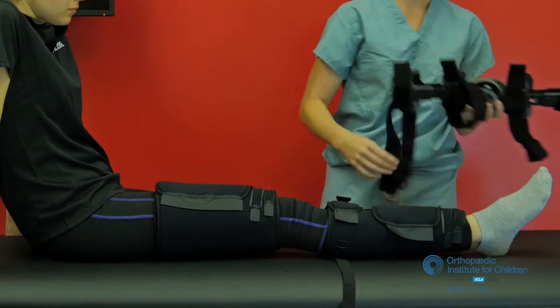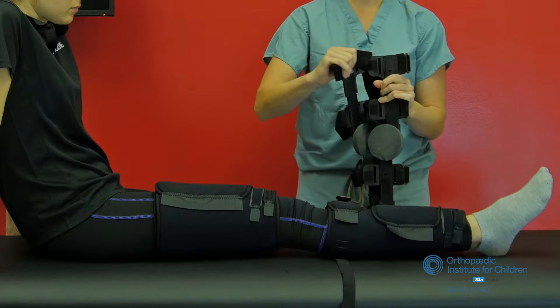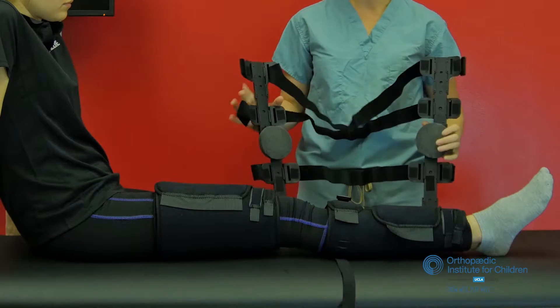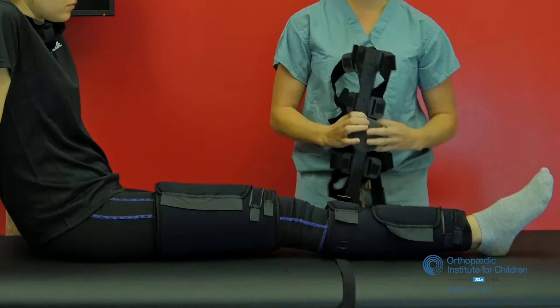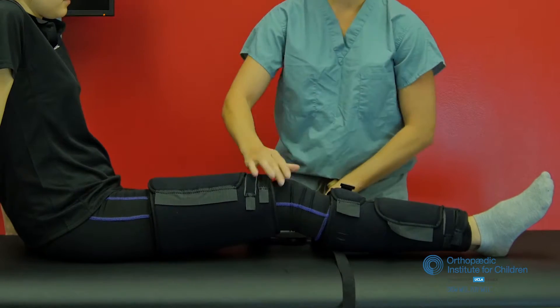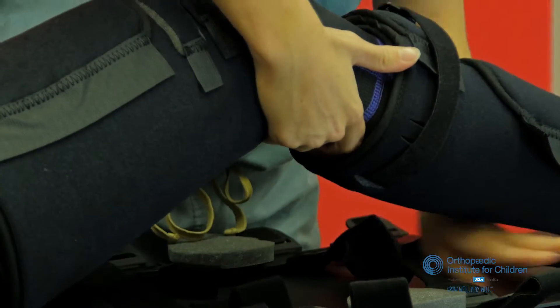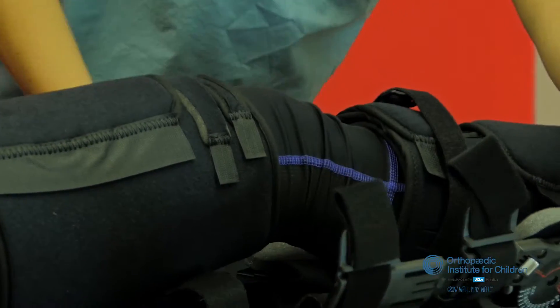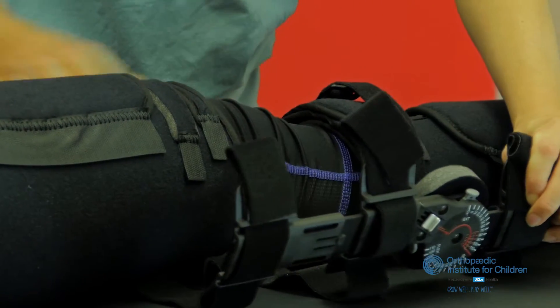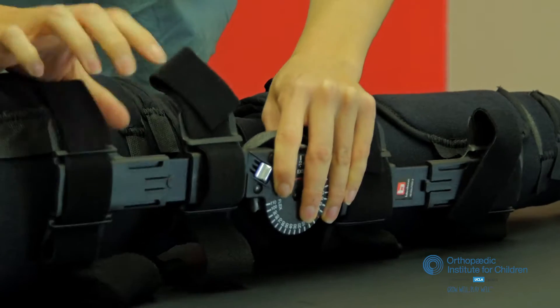This is the metal portion that actually has the hinges. You can see that there are many different spots of Velcro and this looks like a very complicated brace. Most important thing is that those knee pads end up on the side of the knee, right at where the knee flexes. Slide one side of the metal underneath to the outside of the knee, and again that small disc area should fall right over your knee.